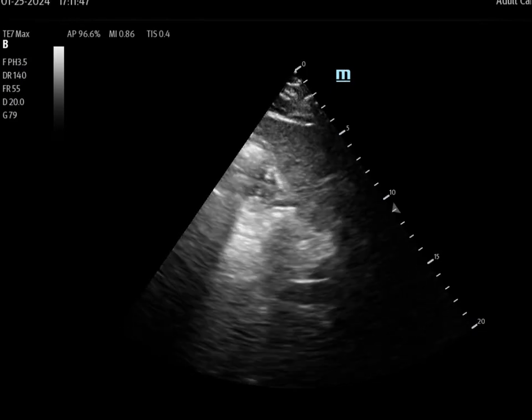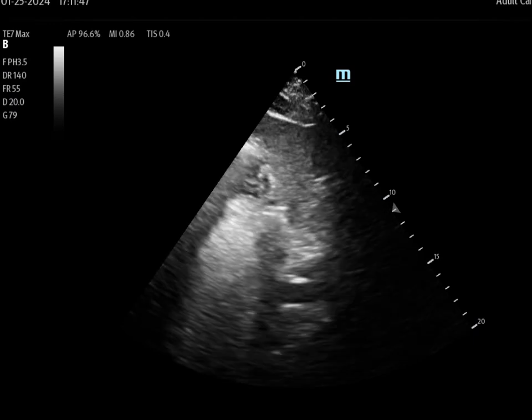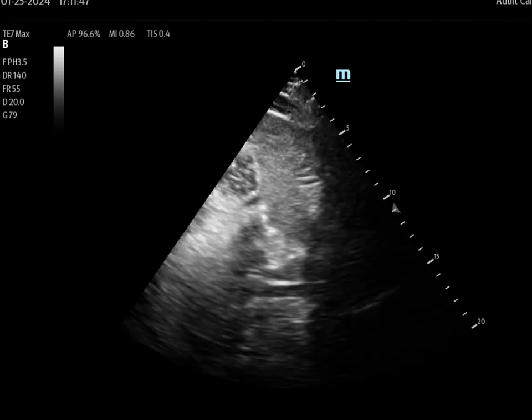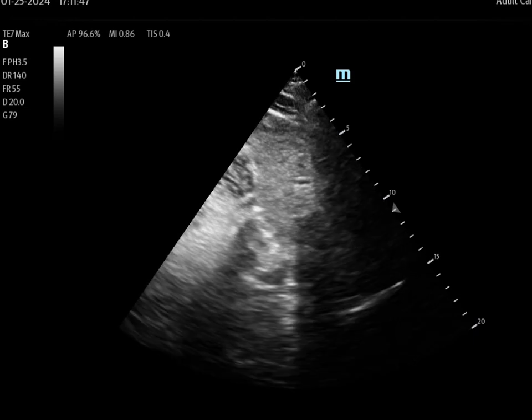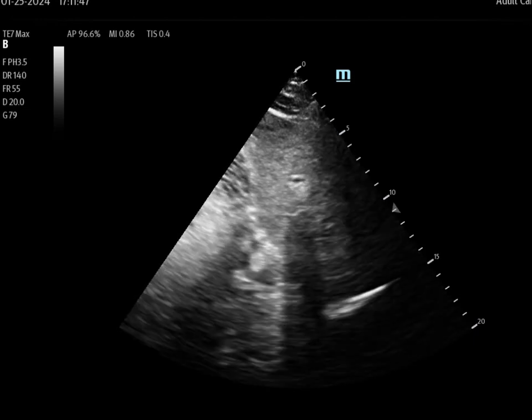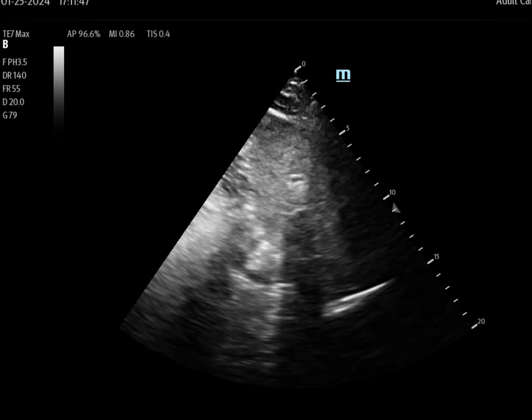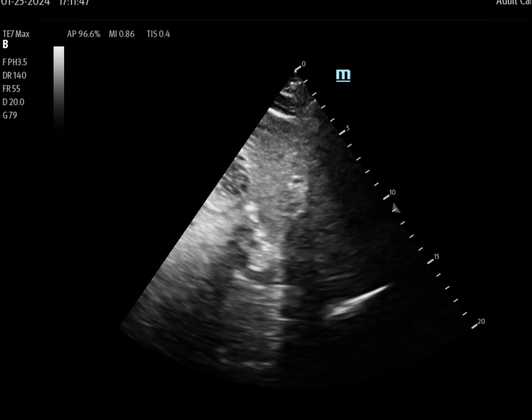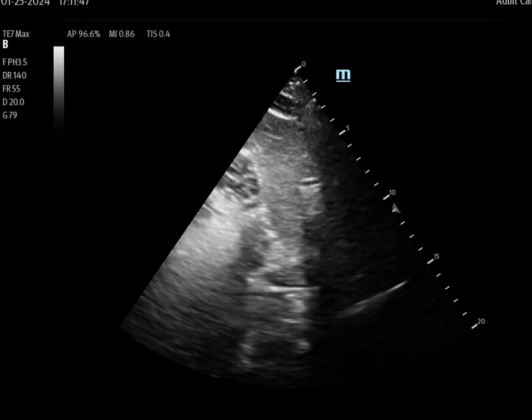The next hemogram was due the next day, so they ended up getting blood. They had already received the 250 mL bolus by the time they got blood, and when I came back to place a line, it was extremely easy. You will note that the liver and IVC are oriented to the right — an incorrectly oriented ultrasound tech had flipped the image, which is why you see it that way.